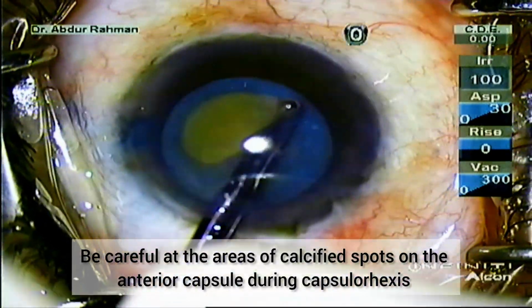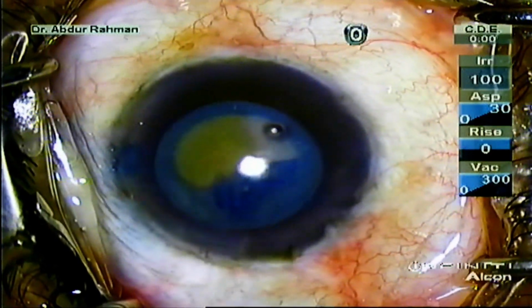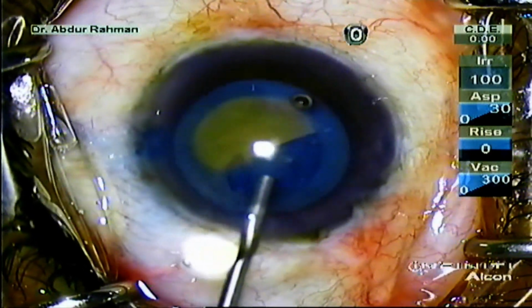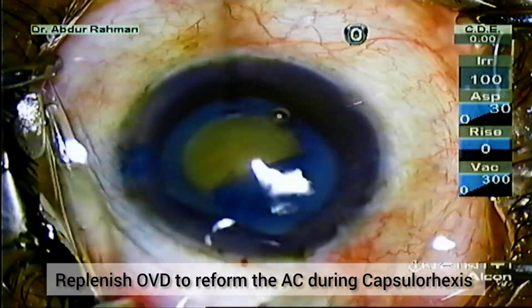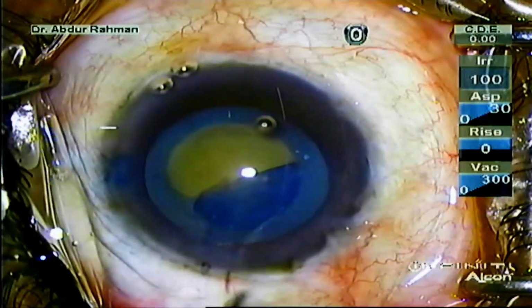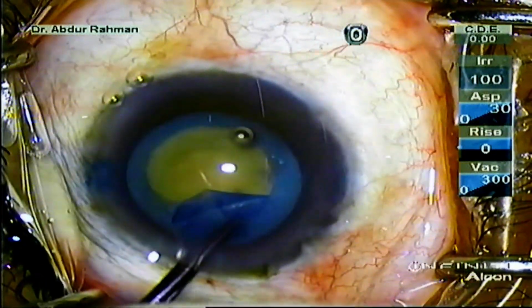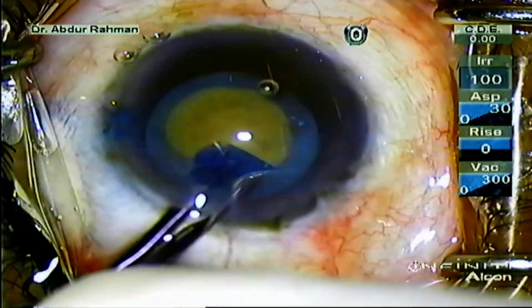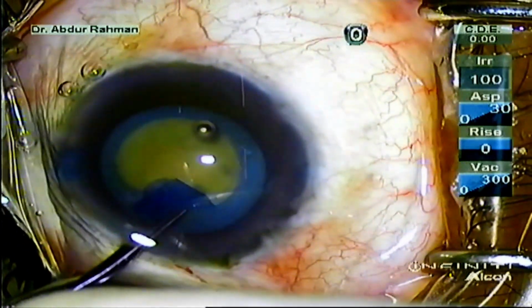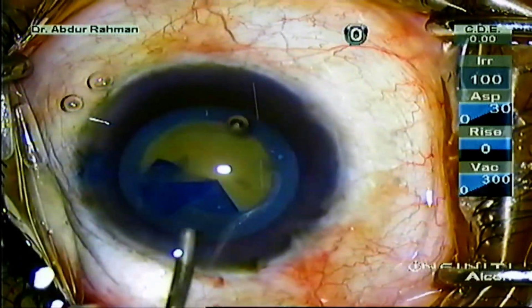Be careful, there are some calcified areas in this anterior capsule. So be careful while pulling and tearing the rhexis over those calcified spots. Always replenish the anterior chamber with OVD to have a flat anterior capsule while making the rhexis. This will cause less chance of the rhexis extending to the periphery.